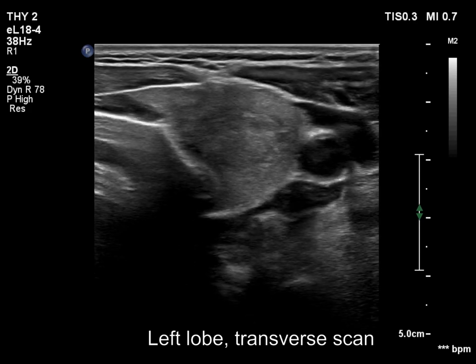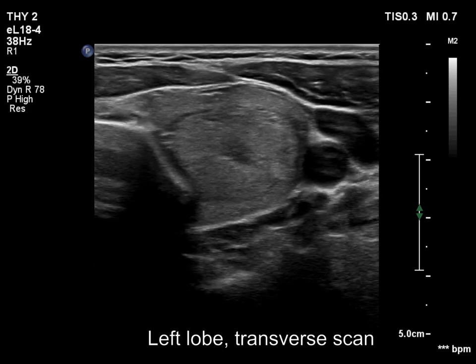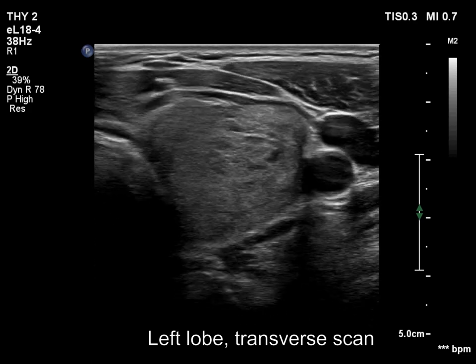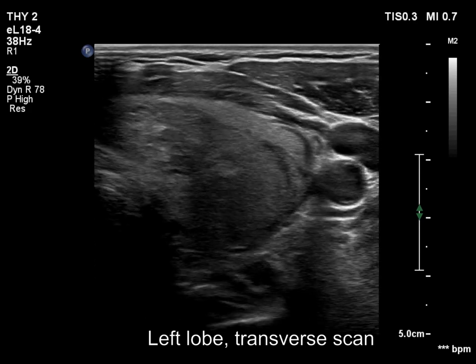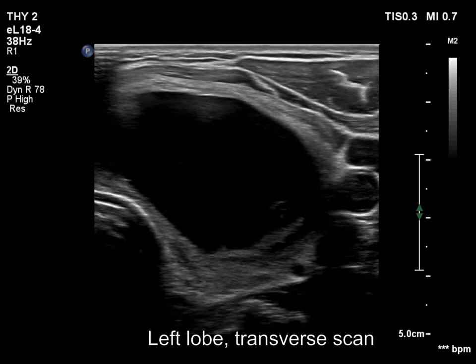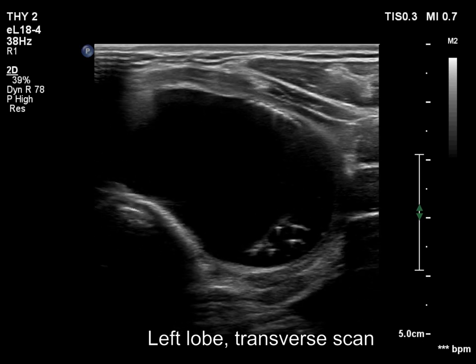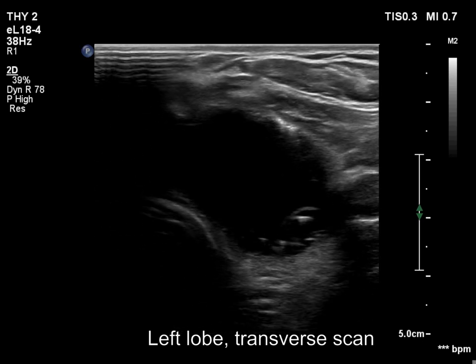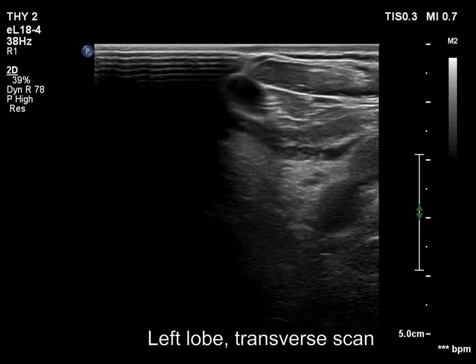The left lobe has a relatively large isoechoic nodule. Here is a smaller lesion, while in the lower half, there is a large cystic nodule.